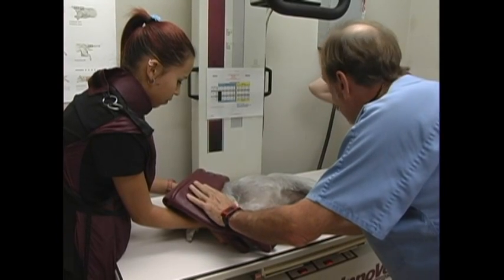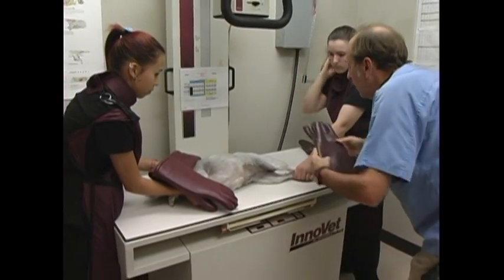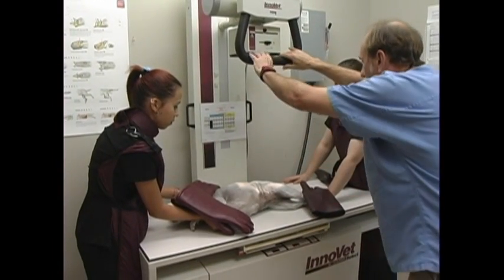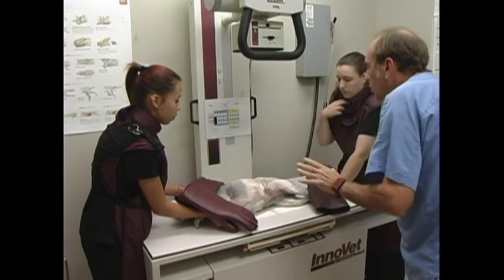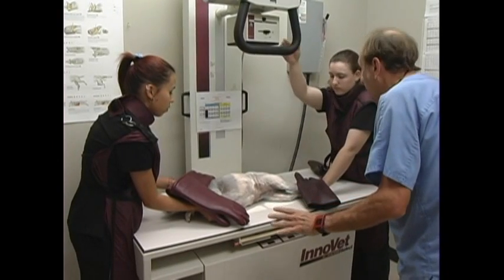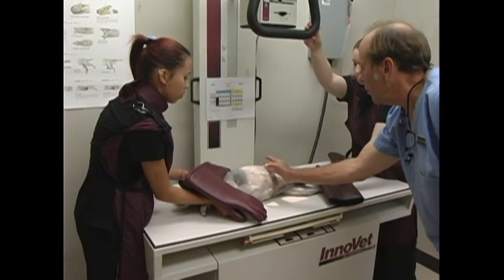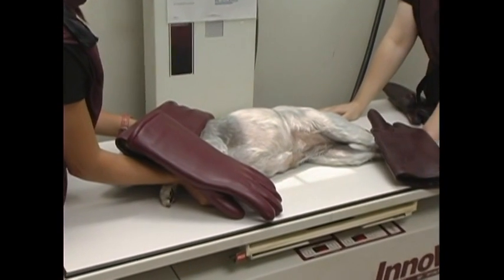And now, that way we're protected, and you don't need these, and I'll help cover your hands. Okay, very good. Alrighty, turn on a light. Is that how you do it, right? Okay, so I'm going to help you. Now, it's better to position the table as opposed to the pet, because the pet's happy now, right? So let's kind of move the table. Can you do that? Okay, she's going to move the table. All right. I always like to position the lateral right behind the rib. Here's the last rib right here. You had it right the first time. Okay, that's perfect positioning right there.